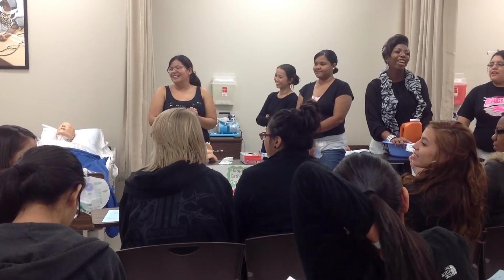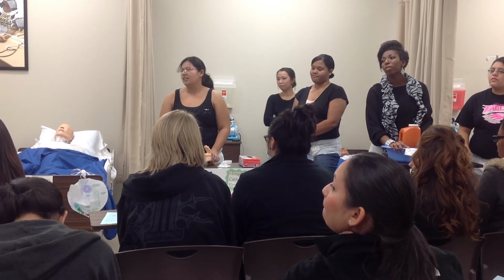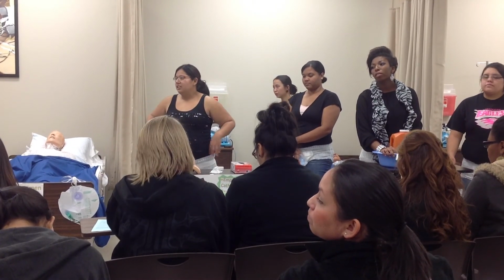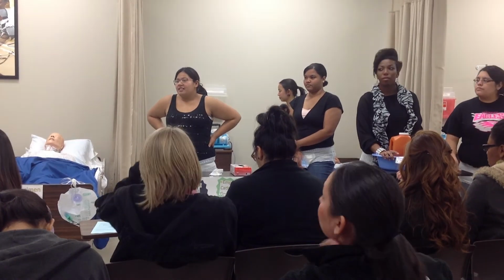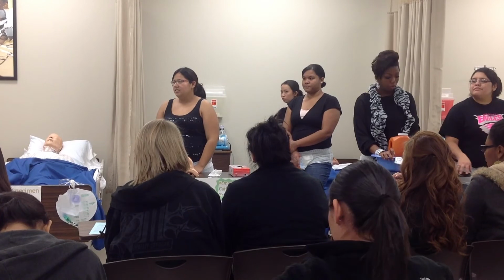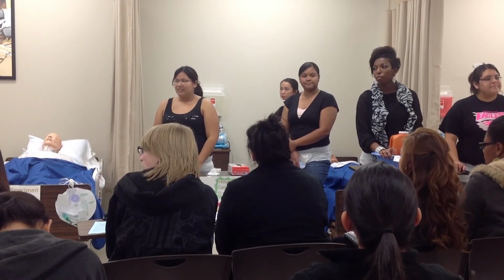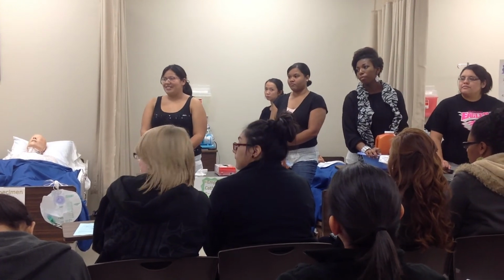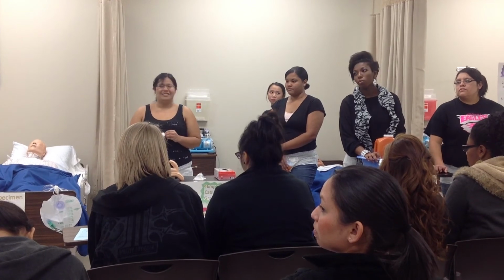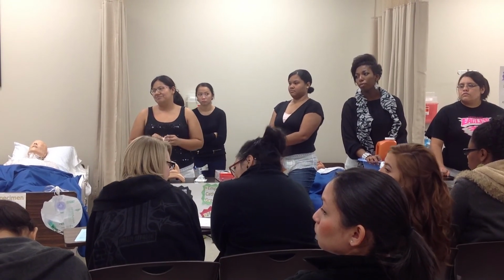The purpose is to keep somebody dry. It's usually a little man who's incontinent. So you put a condom catheter on, you want to keep them dry, keep the urine off. That's the reason, because with the elderly, urine causes skin breakdown. It's less invasive than a real catheter. I prefer this one. Yeah, most people would. But the problem is, it doesn't stay on. Oh, the adhesive comes off? Usually, the patient will take it off. They mess with it so much that it falls off.